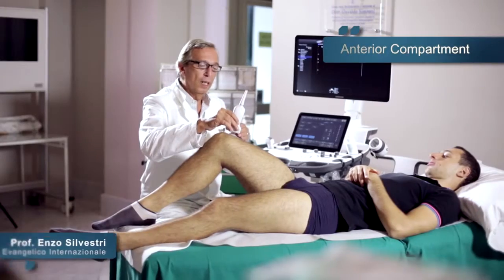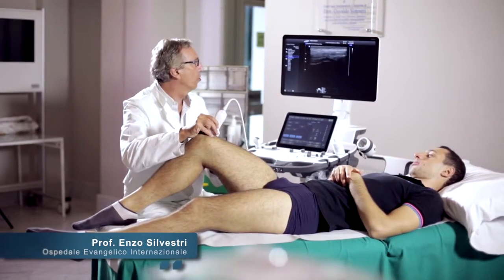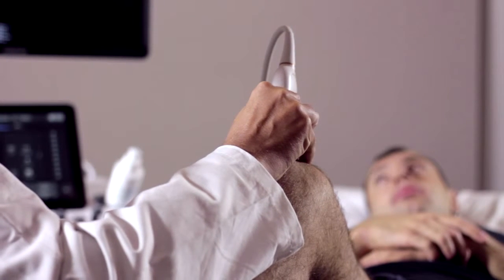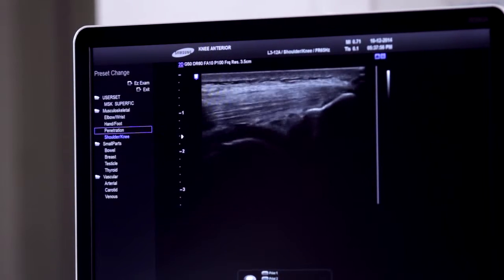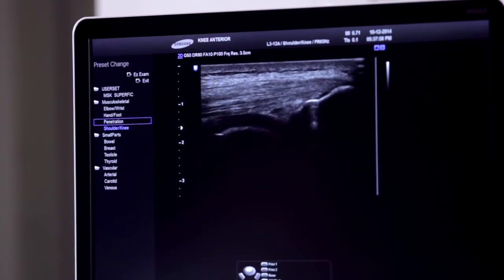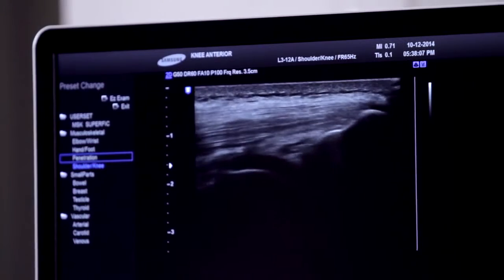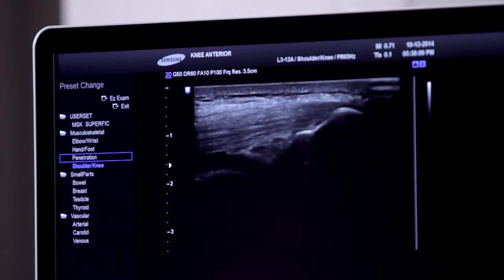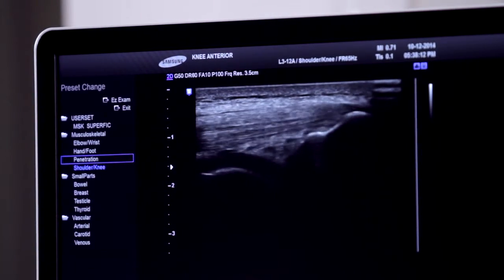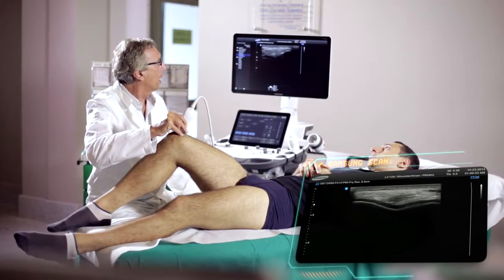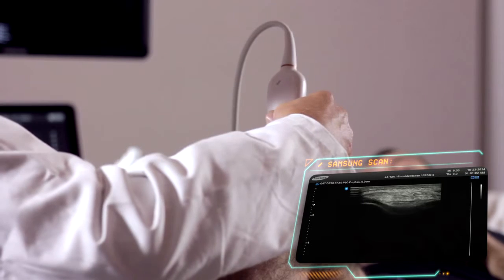We start with the assessment of the quadriceps tendon using scans that cover the major axis. We can see the characteristic appearance, which is quite complex as this tendon originates from the fusion at the aponeurosis of the muscle bellies of the quadriceps femoris. We study it along the course up to its insertion. Here you can see, at the level of the superior rotular pole, that the fibers have this characteristic appearance at the insertion. We will also use a short axis scan with another axial reference plane.